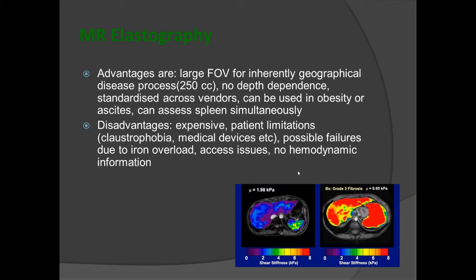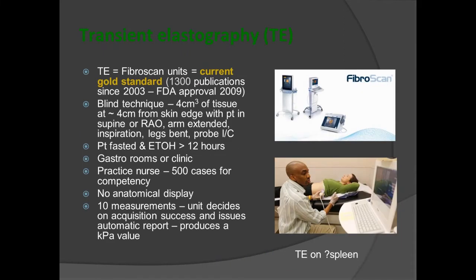Now, we're not going to spend a lot of time this evening talking about MR elastography because that's something that we don't routinely do as sonographers. But I think it's important that people realise that people do have MR elastography. It's an important tool. It's basically driven by a driver that sits under the patient.